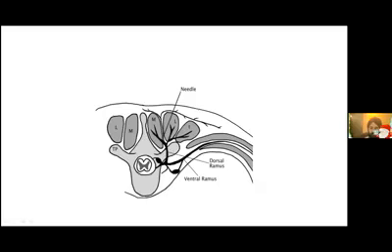So in a way, by depositing the medicine here, deep to the erector spinae muscle, it reaches the dorsal rami also, and it reaches the paravertebral space, which is believed to happen through the costotransverse foramen, or through the ligaments which are there, the intertransverse ligaments. So the medicine is believed to spread through there, and it reaches the paravertebral space.